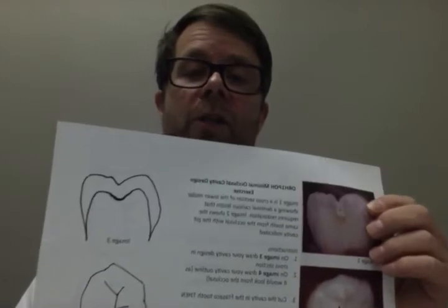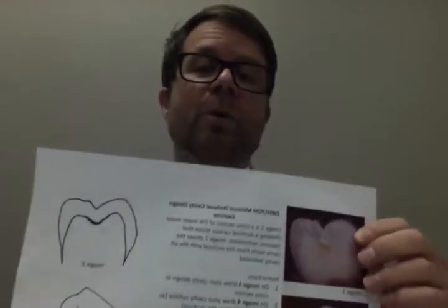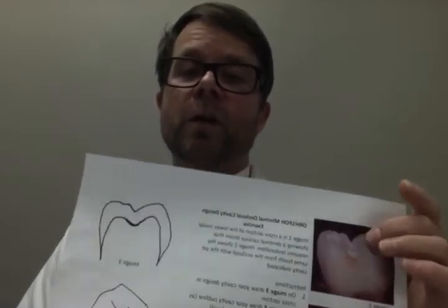Discuss with your teacher your drawings or your proposed design, and they may suggest to you some modifications to that design, which you can then alter on your drawing. Then what you need to do is to cut the cavity.